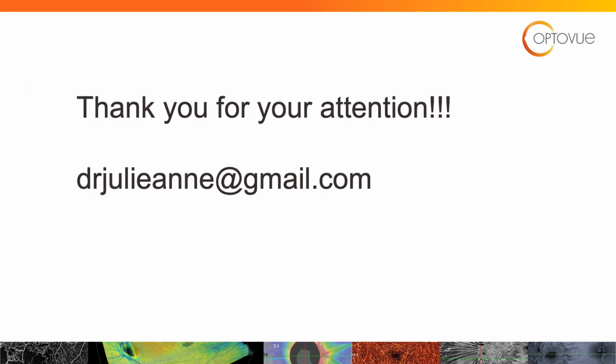I hope that this small tutorial shows you the efficacy of OCT angiography and will help you to apply this excellent technology to your practices.